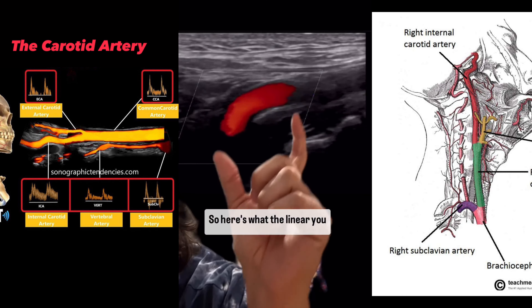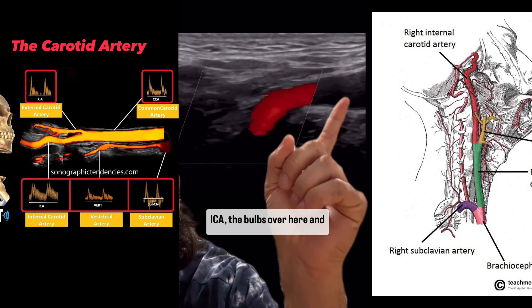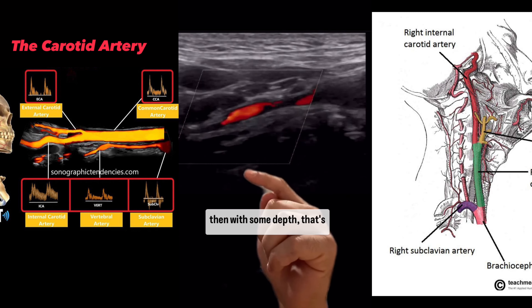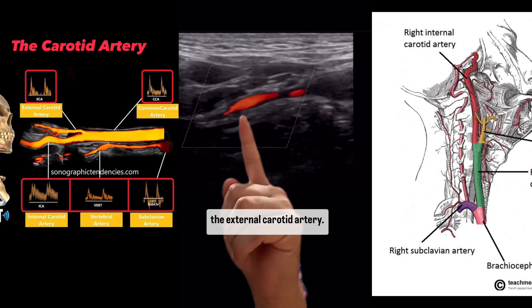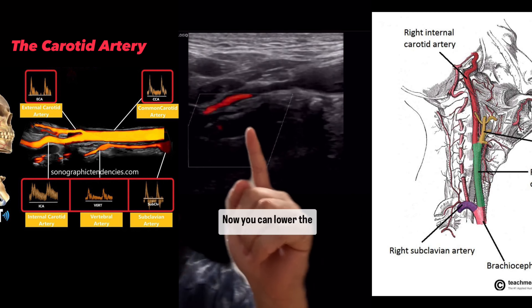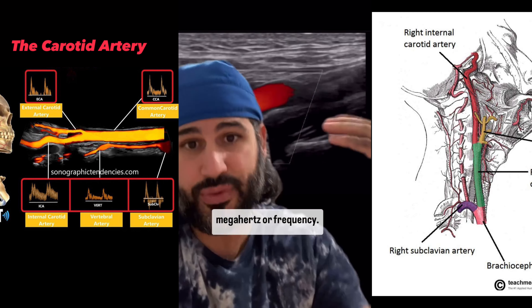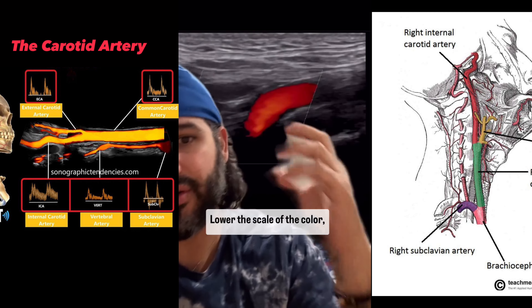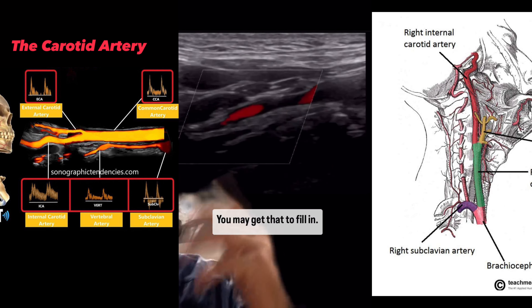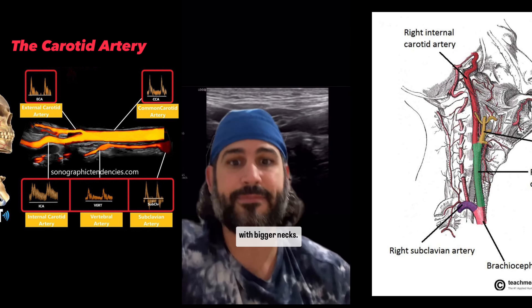With the linear probe, you get this short segment of ICA — the bulb's over here. With some depth, that's the external carotid artery, and you can see there's some more there. You can lower the megahertz or frequency, lower the scale of the color, increase the gain — you may get that to fill in. But sometimes it's very difficult, especially with people with bigger necks.